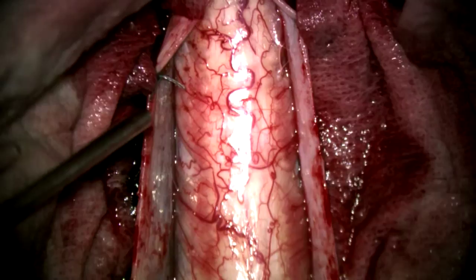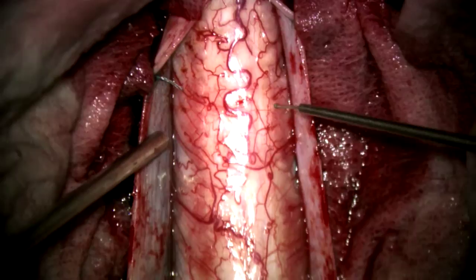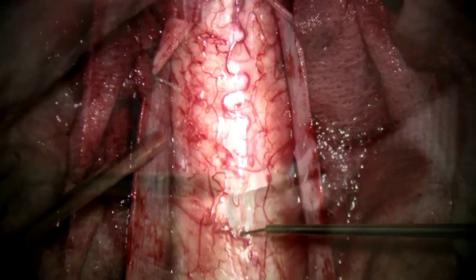After opening of the dura, identification of the midline was a very important step, where the site of the maximum expansion of the cord, the midpoint between the two dorsal roots, and the site of convergence of the vessels was identified, preparing for opening of the pia and myelotomy.